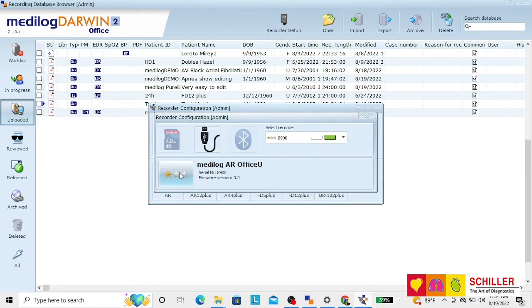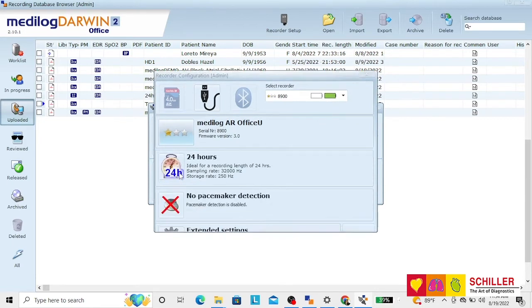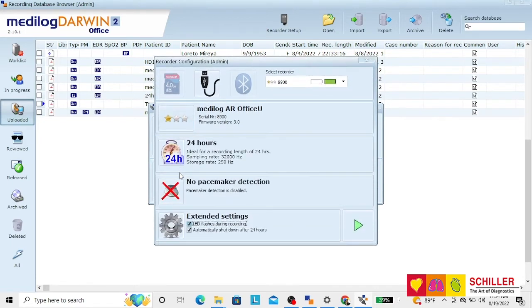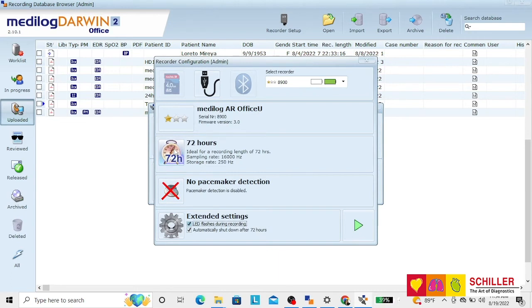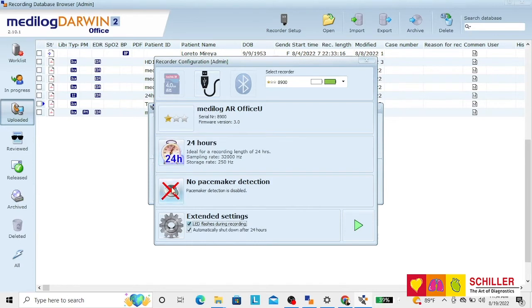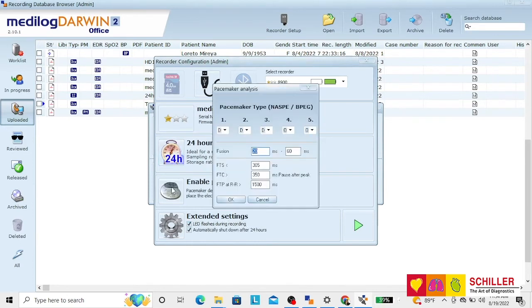Click on the stars and then you can select the length of your recording. 24 hours, 48 hours, 72 hours or open-ended. You can select if the patient has a pacemaker or not and program the pacemaker.